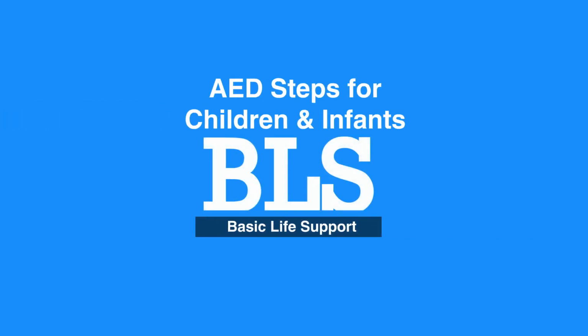Chapter 6, AED for Children and Infants. Welcome to the AED steps for children and infants. In this video, we will discuss how to use an AED for children and infants.